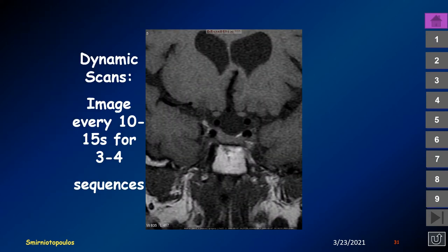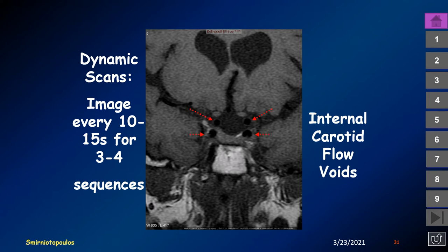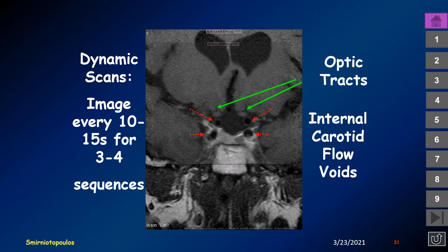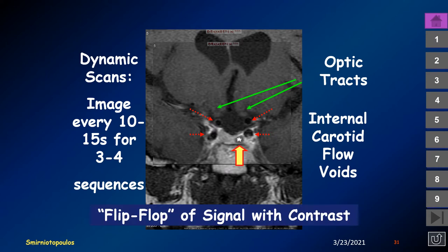This patient has a pituitary microadenoma. Detection of microadenomas involves thin sections and dynamic imaging. The normal pituitary gland enhances earlier and washes out earlier than the sparse vascularity of a microadenoma. With dynamic imaging, we can see the normal gland enhancing early, while the pituitary microadenoma appears as a delayed enhancing region inside the pituitary gland.